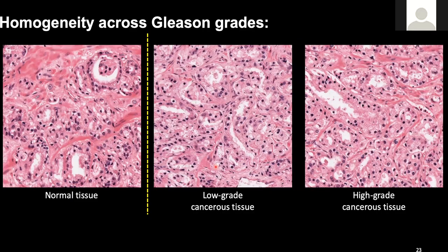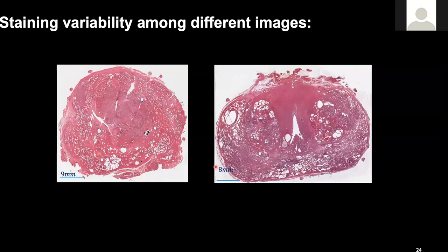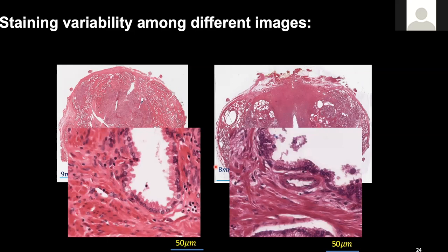Another challenge is the homogeneity of the tissue patterns. I've listed three examples of normal tissue and cancerous tissue. By a layman's perspective, it is very hard to tell the difference between the normal tissue and the cancerous tissue, and so it is also hard for the system to differentiate them. A third major challenge is staining variability. Although the tissue is being cut and processed at our one local center following exactly the same protocol, and we use a robotic stainer, the staining variability is obvious as you can see when zooming in.